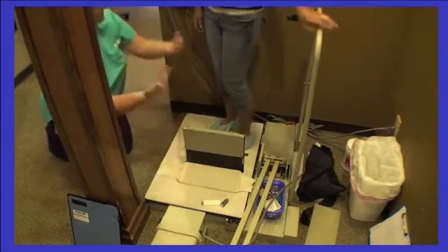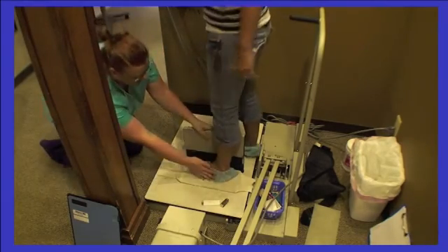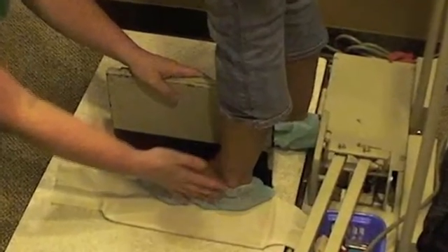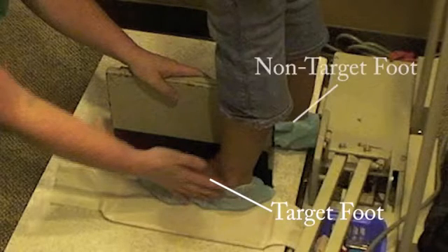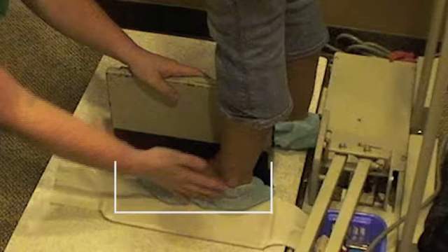Have the patient turn to the side which will allow the foot you want to take a picture of to face you. For instance, if you want a lateral of the left, you'll have them turn to the right. And likewise, if you'd like a lateral of the right, you'll have them turn to the left. To position the patient, have them place the target foot on the side of the cassette closest to you, and the other foot on the other side of the cassette, so that they're straddling the cassette. You'll want to make sure their foot is within the dimensions of the cassette, so you'll get the whole foot in the view.